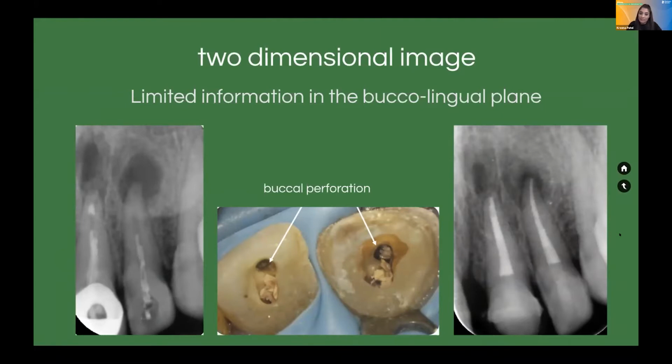So although they had these perforations, I repaired them, and this is a 6-month review radiograph, and you can see that the lesions are healing nicely. But if I had had this information prior to treatment, it would have made a significant difference to us.